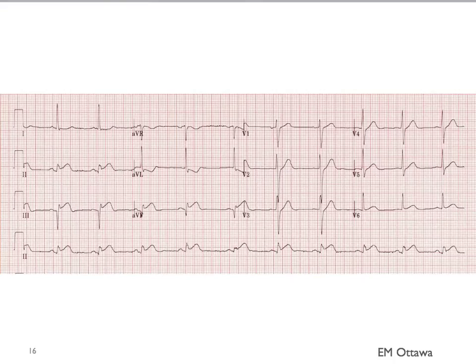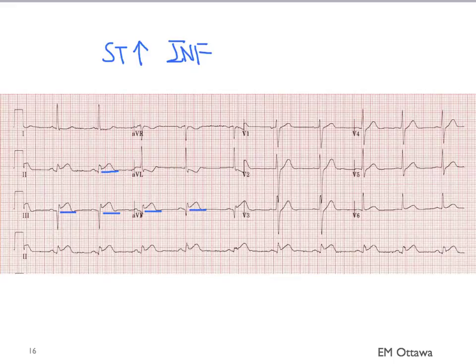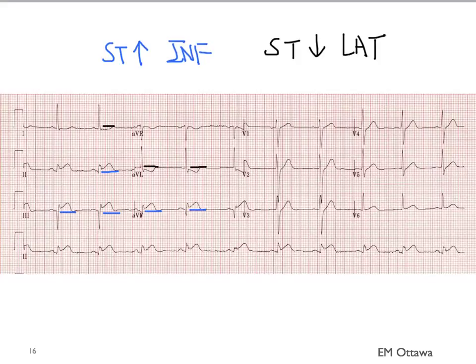Let's go through some examples. Here, identify the ST elevations and ST depressions. The ST elevations are in the inferior leads and belong to the same territory. Do you see the ST depressions? They are in lead 1 and AVL — the lateral leads — and the depression in lead 1 is very subtle. Therefore, this is an acute inferior ST elevation MI.